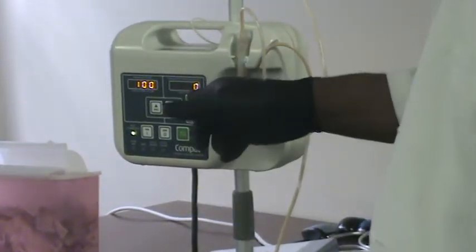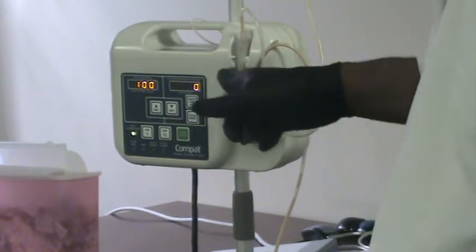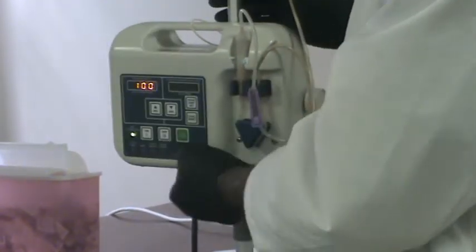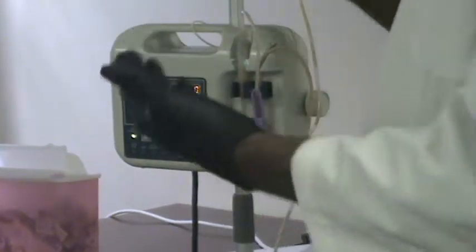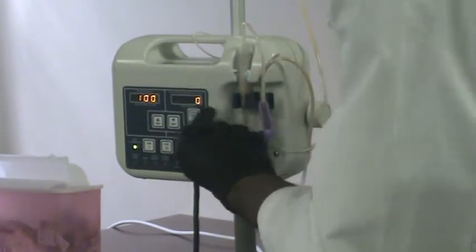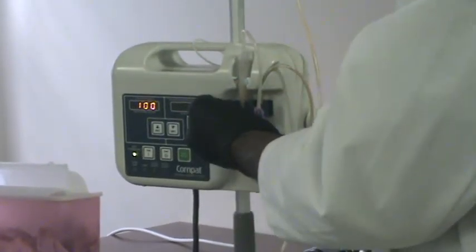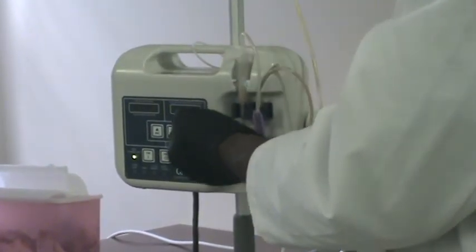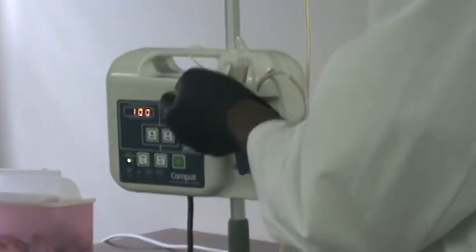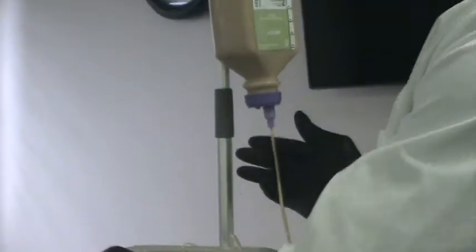And every ml that goes through the machine, that will turn to 1, then to 2, to 3. Every hour that goes by, you should see 100 here, and then 200 the next hour, because her order says that she should have 100 ml per hour.